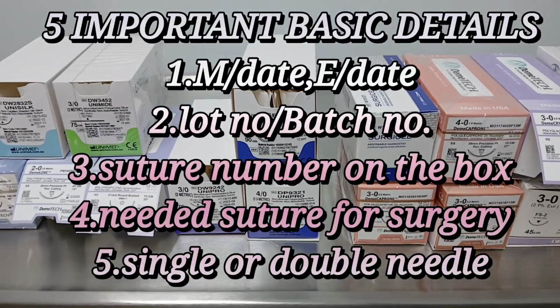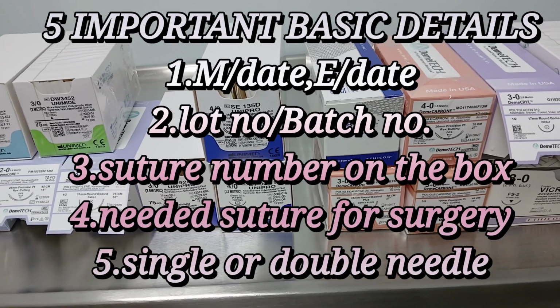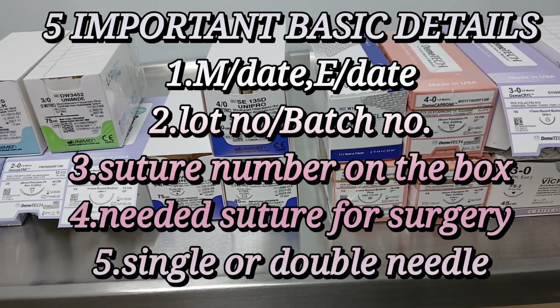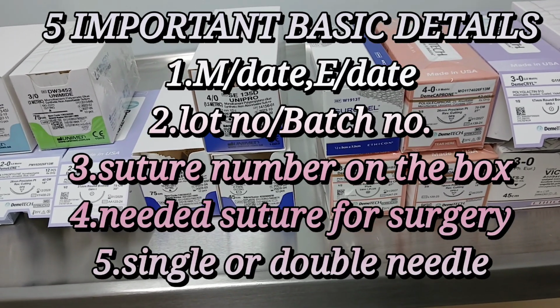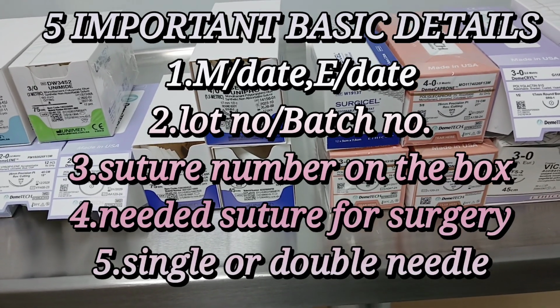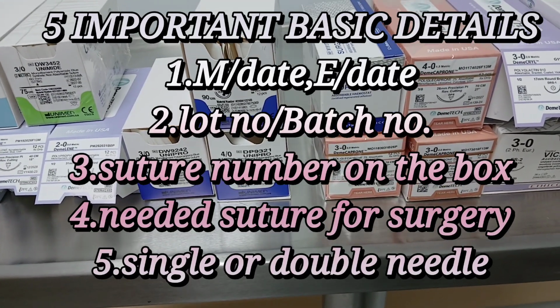First we have to check the manufacture date. Then we have to check the expiry date. Then we have to see the lot number or batch number. Then we have to see the suture number, what number is available on the suture material. Then what kind of suture we are going to use in the surgery. Then we have to see single needle or double needle. So total 5 points are there.